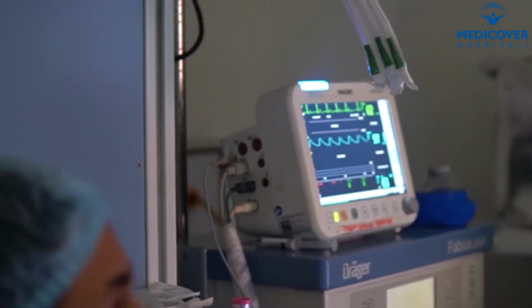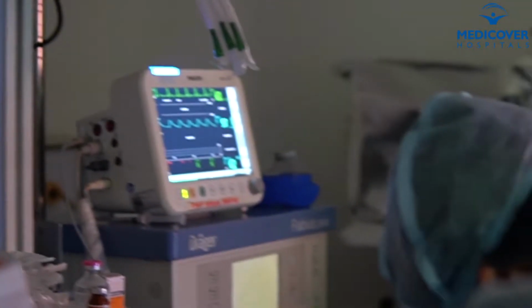Now, as the patient sleeps and he or she starts snoring, I keep a look at the monitor, which is the anesthesia monitor, which can show us how the oxygen saturation is, is it maintaining at 97, 98, or is it coming down below 90. I also observe the patient's chest movement and how the airflow is happening through the nose. That tells us whether the patient is having apnea or not. Apnea is stoppage of respiration for a few seconds, which is dangerous for our heart and brain.